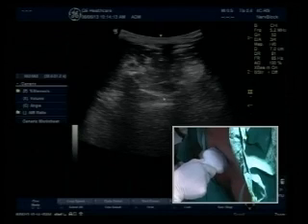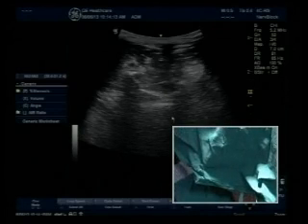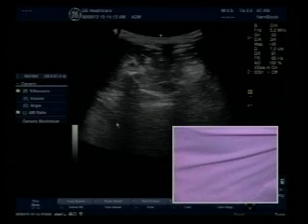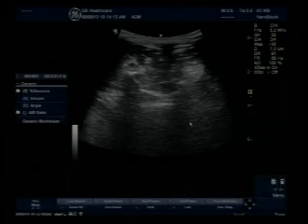And now you can see on the picture something called a bat wing appearance. I'm just showing it through the pointer. Please follow it. Can you see that, like a bat wing? So that is something you will see when you're interspinous.